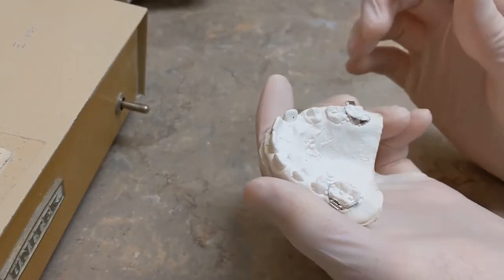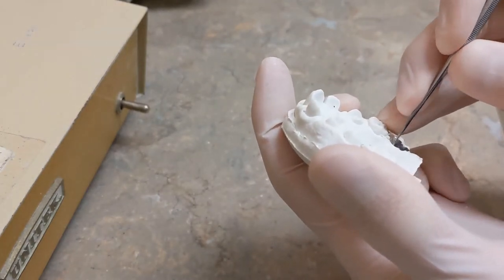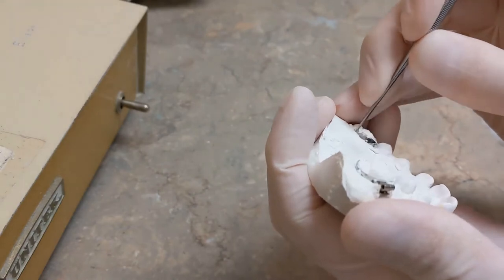To make a Nance appliance, the first thing you do is clean the flash of stone off of the bands, because this is where you're going to solder the wire. You want to clean any stone off of there — you do that with a little sharp instrument, just get in here and it flicks right away.